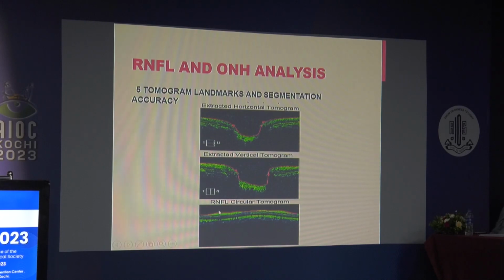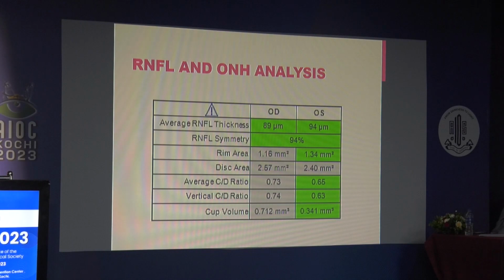And similarly for the RNFL, there is segmentation here. So you have to check whether the segmentation is proper or not. Now we have reached the value which we see at number 1. So here we can see the green color is there, gray color is there.